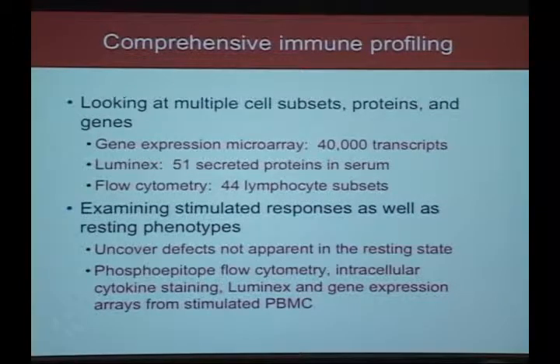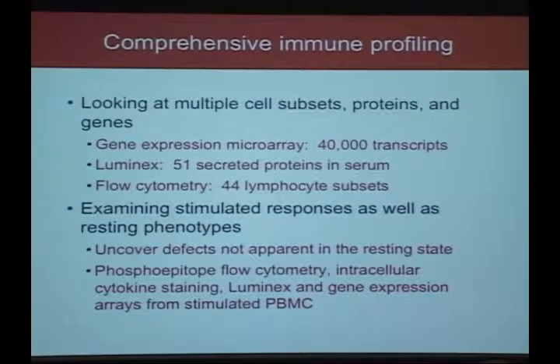And so being comprehensive allows us to meet the needs of many different projects with regard to the analytes that we're looking at. And it also serves that third goal of allowing us to then amass the data, because it's the same assay. It's a relatively comprehensive data set, and so we can really gather data beyond what might have been intended for the original investigators' questions. And so this is just an example of some of the subsets or the analytes that we can look at by the different platforms.